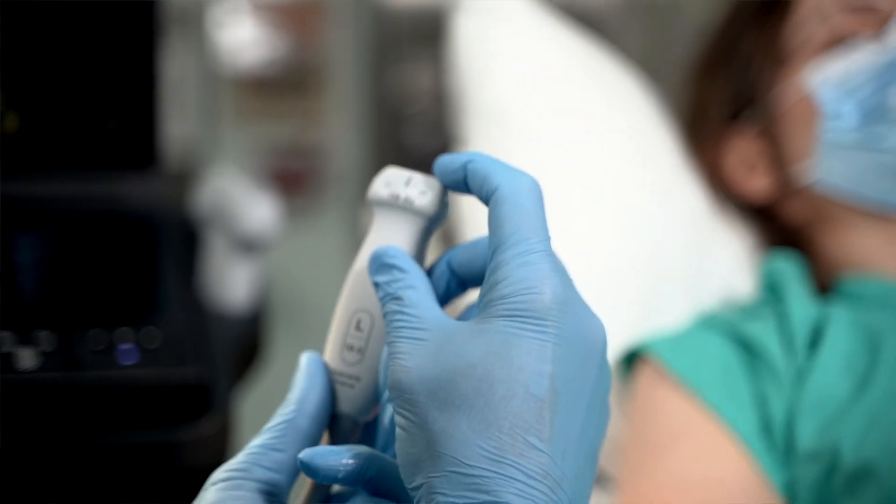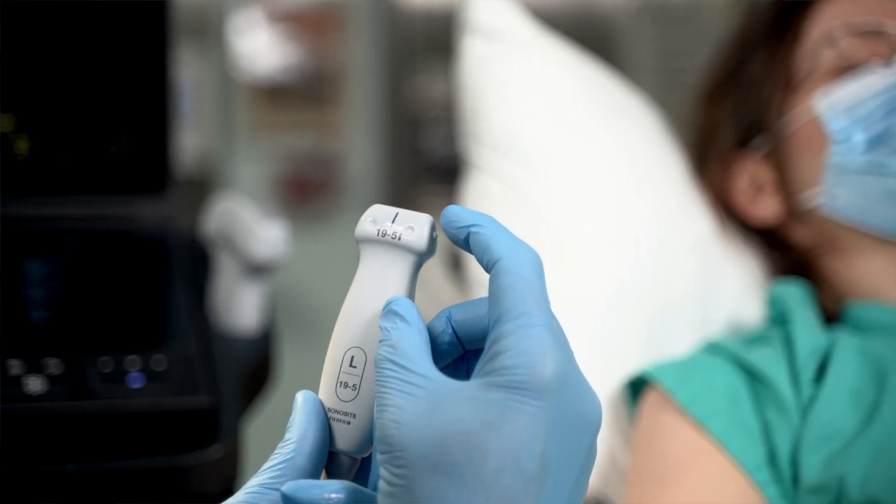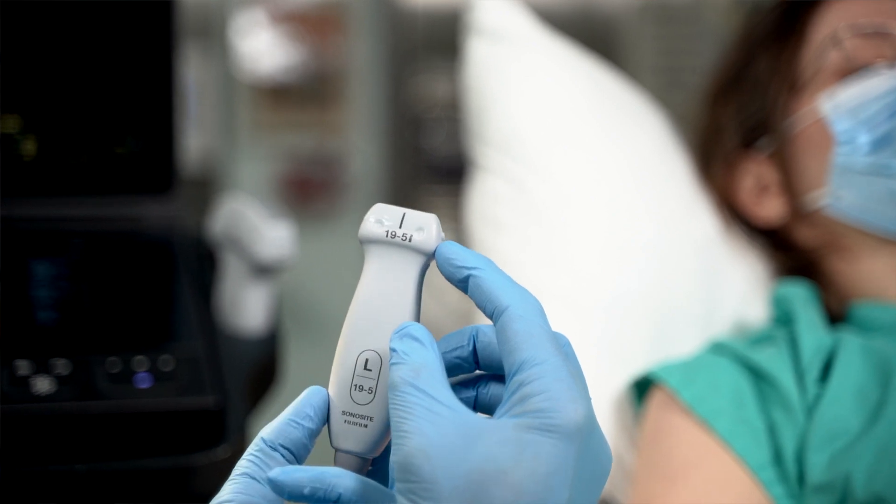For vascular access, you should use the high frequency linear probe as this will give you the best picture when looking for vessels. There will be a mark on one edge of the probe which corresponds to the leading edge, and there's usually a dot on the screen to correspond with this. You should orientate your probe before using it to make sure you have it the right way around, and usually the best way to hold it is with the leading edge towards you or the patient's head.